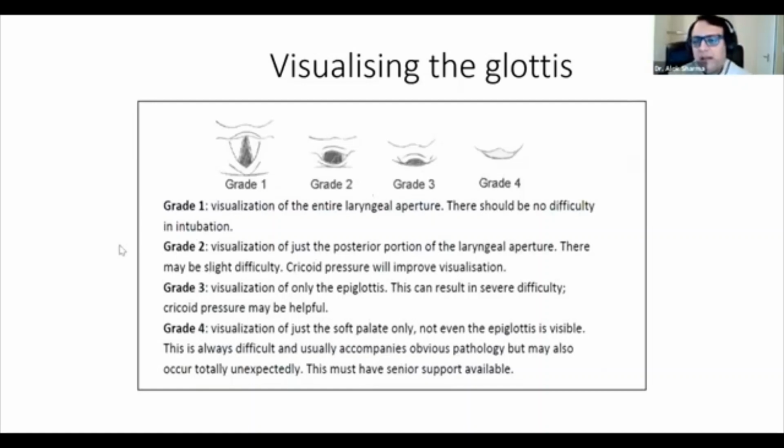And what we've trained and what we emphasize to our trainees when they have their first attempt at intubation is trying to have some idea of what grade of intubation this is. Were they able to clearly visualize the glottis and vocal cords? What was the reason that they failed? Was it secretions? Was it the tube not being curved anteriorly? Or alternatively, was this a grade 3 view and this baby has a very, very small chin? And once you look at it, you automatically know that the most experienced person should be the next person either managing the airway or intubating this baby.